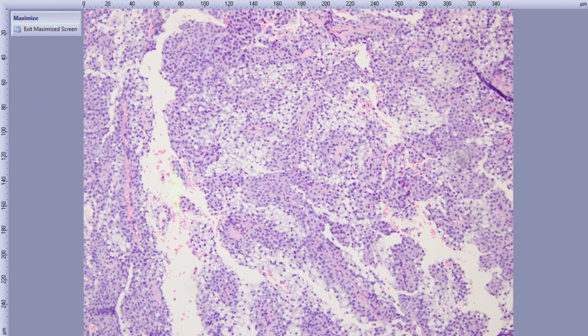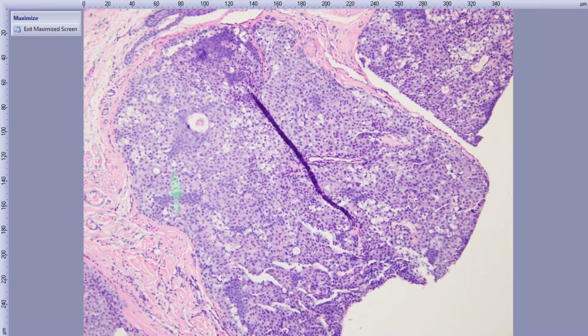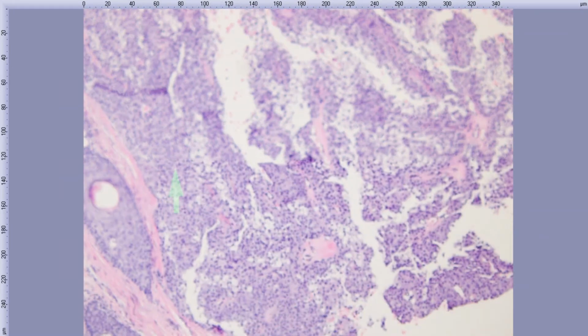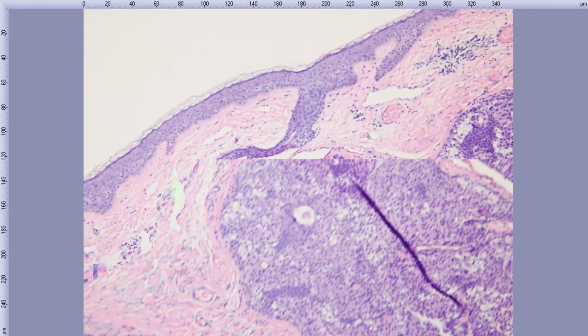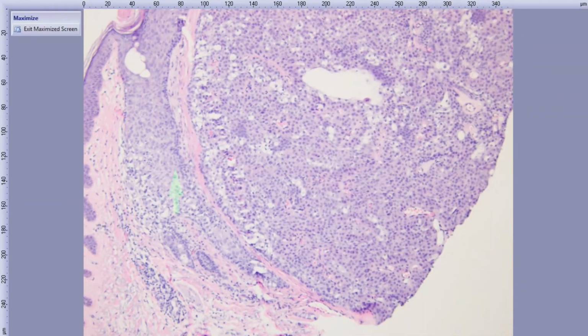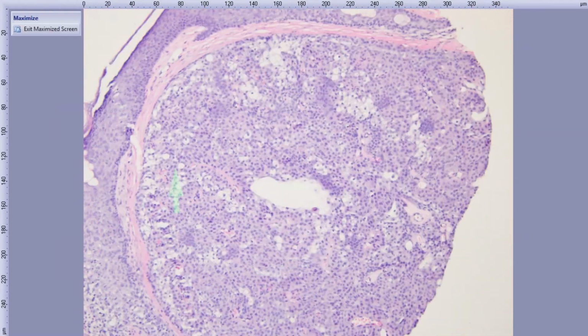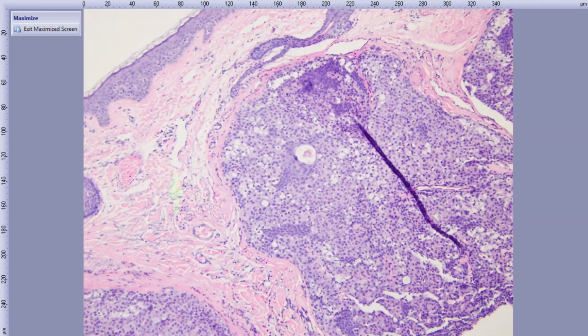It's also admixed, so you've got sebaceous gland mixed with more typical epithelial cells. So this doesn't fall into a sebaceous category. We've got a somewhat predominance of the clear cells and these large nodular aggregates of tissue. So this is actually a hidradenoma. And if we look carefully, we should be able to find some ductal areas right down in here. So this is a hidradenoma.